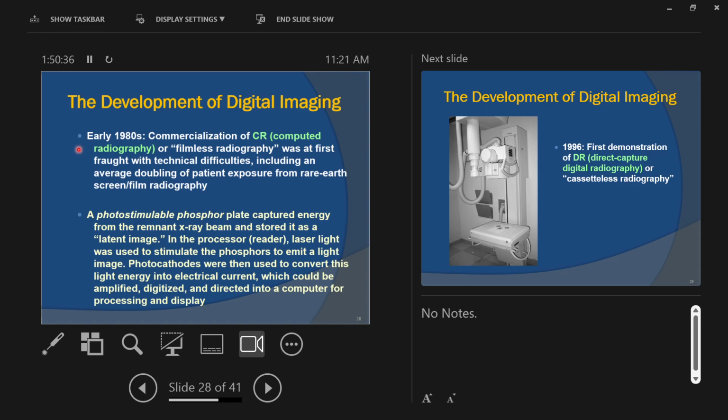Right. So if you ignore patient dose and all that, you're making waste when you use more film than you need, or ruin a piece of film. With digital, it's just computer code. It gets erased. And from an administrative standpoint, it's cost effective. It's expensive to buy these to start off with, but if you're using them heavily, eventually you're going to offset things like the cost of your film. You're going to pay this unit off eventually, and you're not going to be buying film ever.